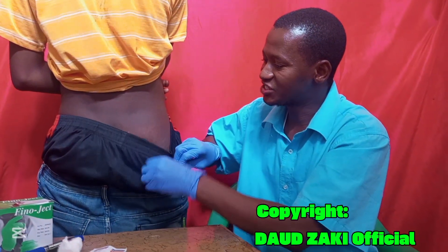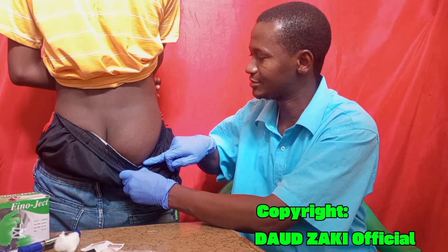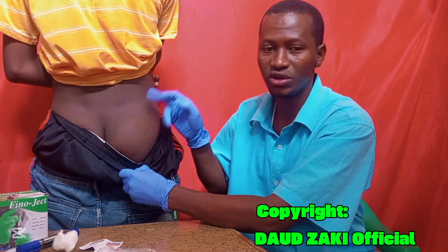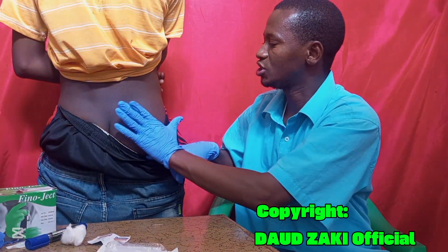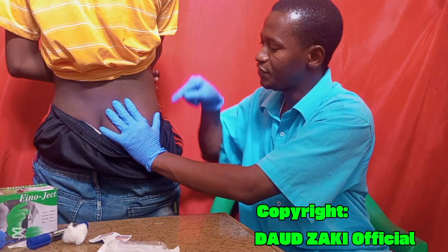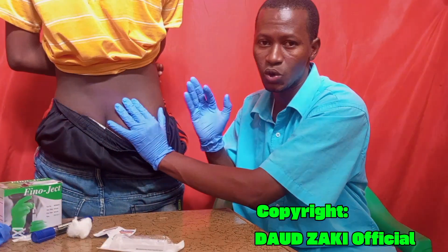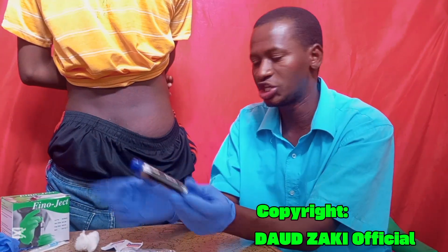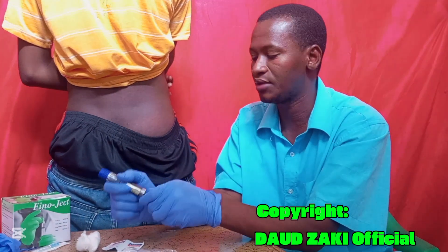Looking at the structure of the gluteal muscle, here is the iliac crest and here we have the greater trochanter. You can use the Z-track method, draw an imaginary horizontal and vertical line, or place your fingers on the injection site. Grasp the skin, insert the needle deep at a 90-degree angle, then administer the drug safely. Watch carefully as I locate the injection sites.